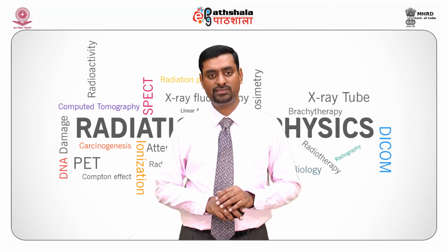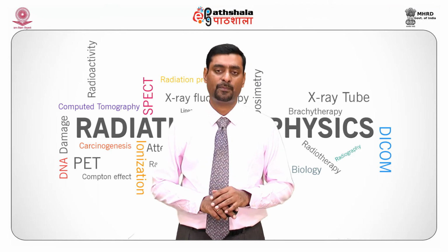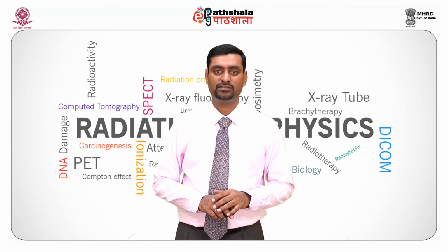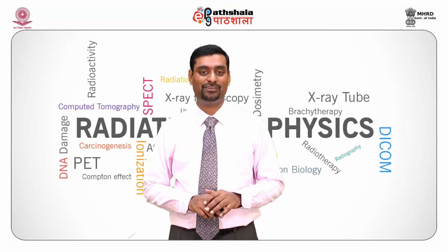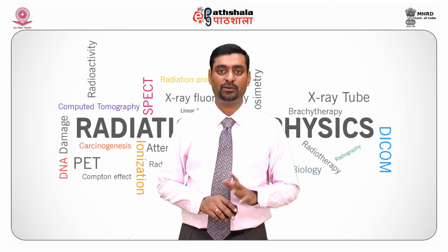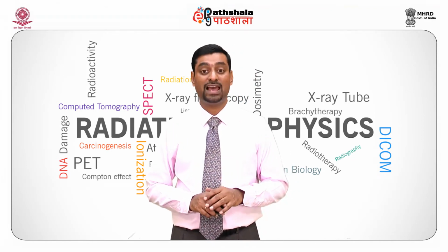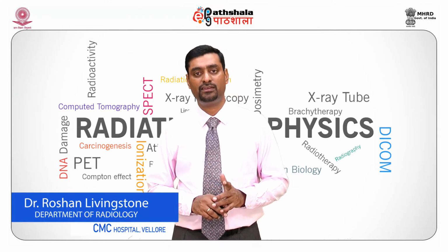Hence, coming to developer, it converts the invisible image into a visible image. What happens inside? Silver bromide grains affected by X-ray exposure are reduced to metallic silver while those unaffected remain unchanged. The developer solution is alkaline, hence the pH of the solution is 9 to 11.